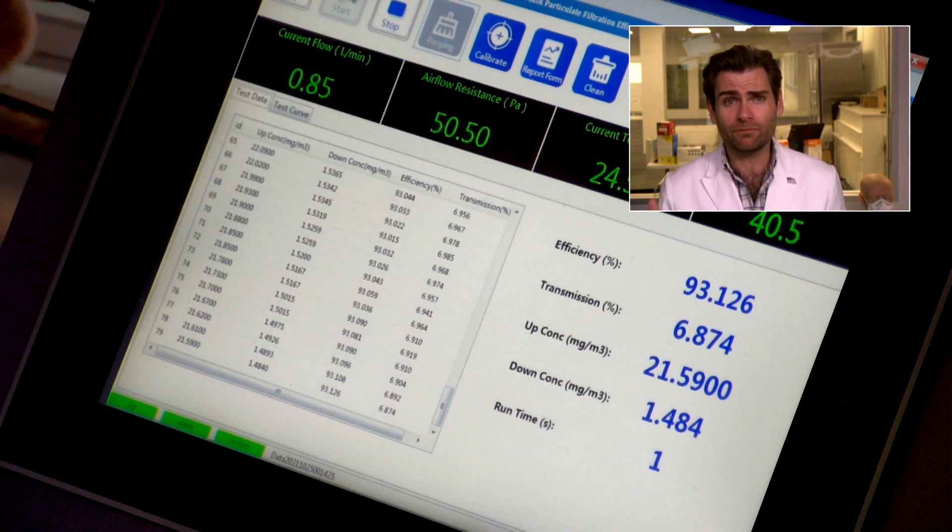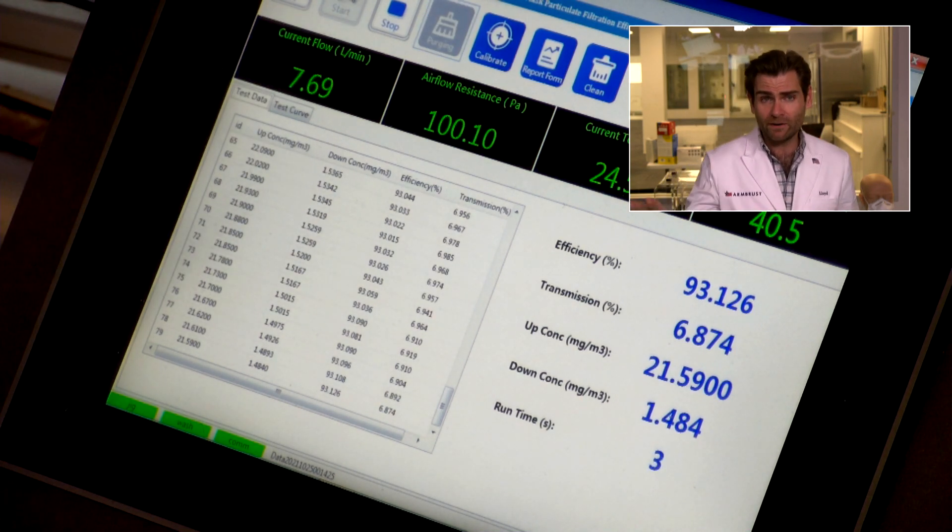This is a PFE machine — particulate filtration efficiency machine. If you want to find out what we're doing here, I'm going to put a link up there, but we're basically doing the N95 test.